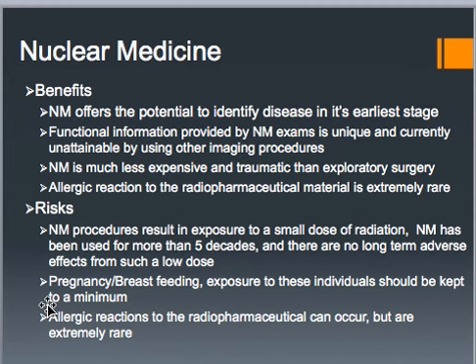So the benefits to nuke med is that it offers the potential to identify these diseases in its earliest stage, which gives better treatment options, right? So the functional information provided by nuclear medicine is very unique. And today, it's pretty much unattainable by any other imaging procedures that we have. It's less expensive and less traumatic for patients than exploratory surgery.